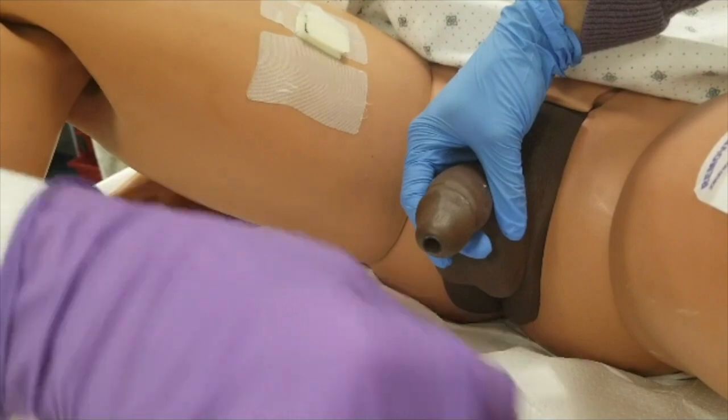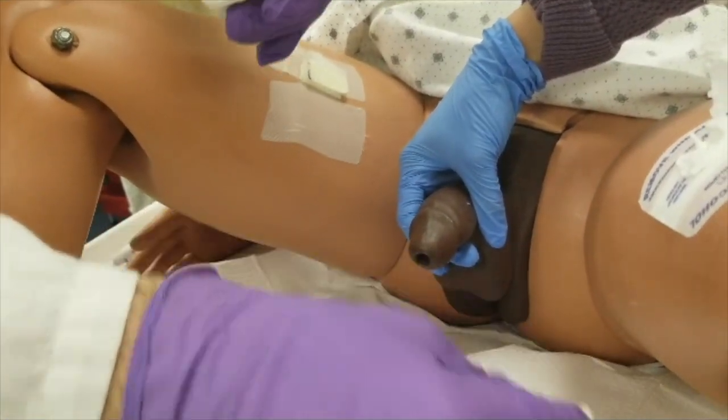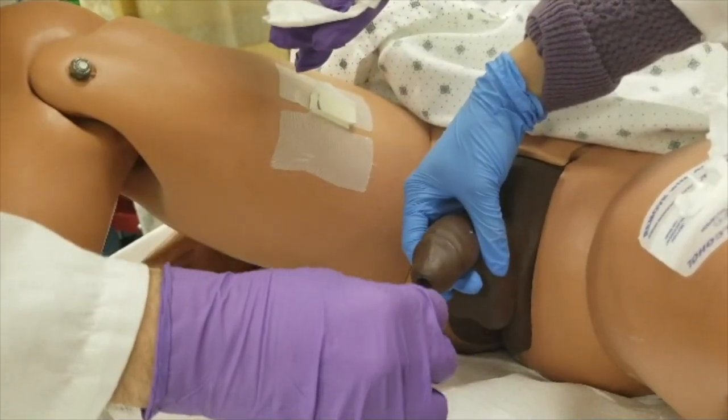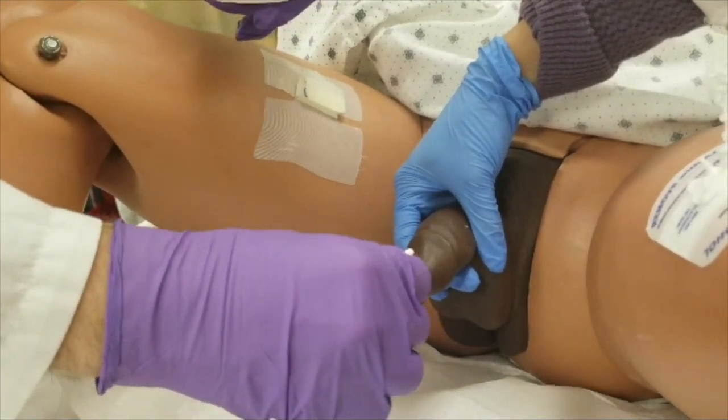When inserting a Foley catheter into a male, you prepare the sterile field the same way you do as the female. The center ones, discard that. Loop around the outside. Go down a little bit further and work your way down, never coming back towards the center.